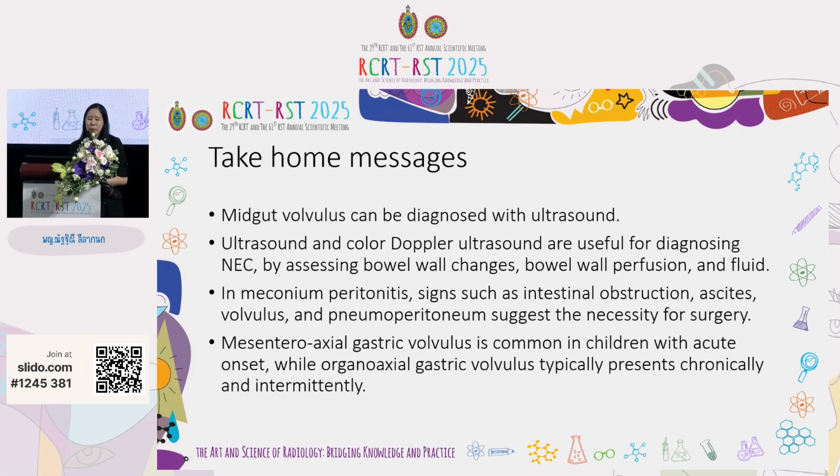Okay, so the take-home message. Midgut volvulus can also be diagnosed using ultrasound. Ultrasound and color Doppler ultrasound are helpful in diagnosing NEC by assessing bowel thickening or thinning, bowel perfusion, and fluid.